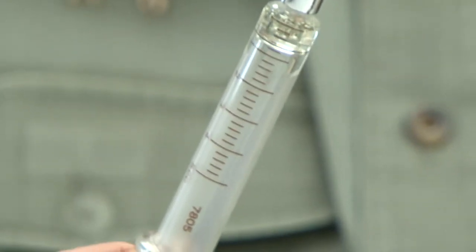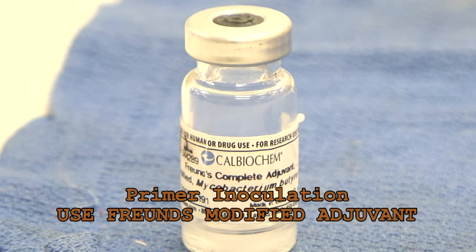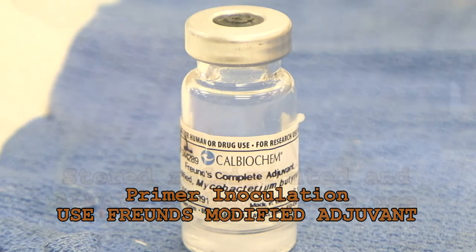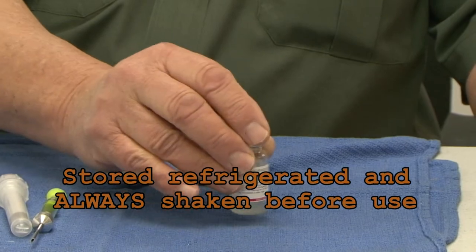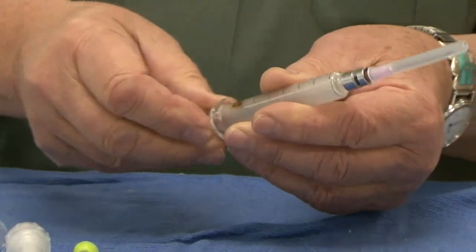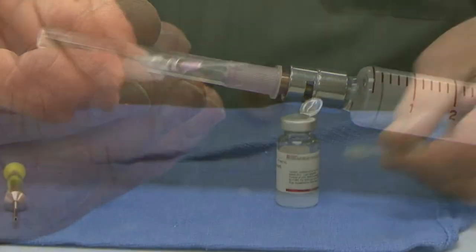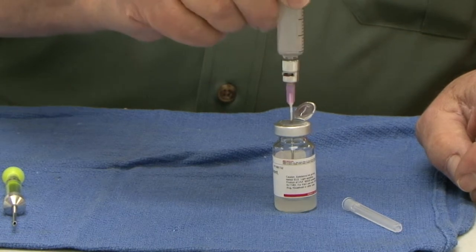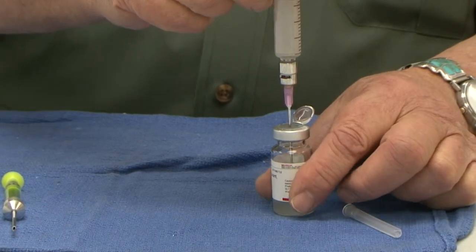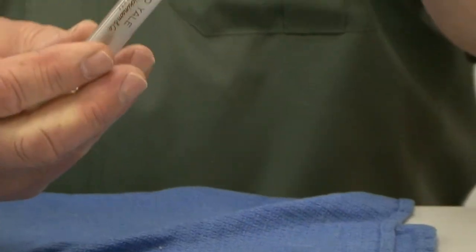To begin, draw up 0.5cc of adjuvant. If this is to be a primer inoculation, use Freund's modified adjuvant, which is stored refrigerated and always shaken before use. Attach the 1.5 inch needle to one of the glass syringes. When you draw the adjuvant up, be sure to use the one-handed method to avoid sticking yourself. Place the vial on a hard flat surface, push the needle down into the vial. Now you can pick it up, invert it, and draw up the adjuvant.